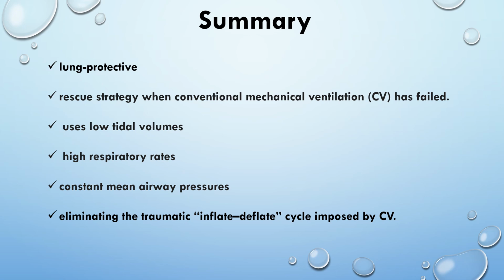Although statistical evidence supporting HFOV is particularly low, potential benefits for its application in many clinical manifestations still remain. High-frequency oscillation is a safe and effective rescue mode of ventilation for the treatment of acute respiratory distress syndrome, ARDS. All patients who have ventilator-induced lung injury, VILI, or are at risk of developing VILI or ARDS would be suitable candidates for HFOV, especially those who have failed conventional mechanical ventilation.